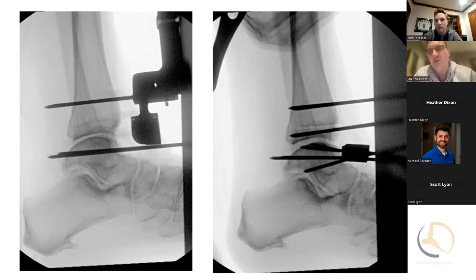I actually take out another millimeter of the tibia to try to get more dorsiflexion — free up a little more space. Then I don't remove as much talus. One more millimeter makes a world of difference — I never thought a millimeter would change anything, but one of my mentors suggested it, and knock on wood, I've not had a problem. So you build in the plan to take an extra millimeter off the tibia and add that millimeter to the talus — it allows me to sometimes put in a slightly larger poly as well.